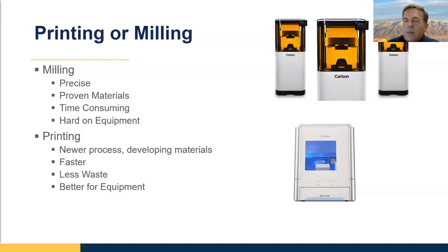And the wear and tear on the equipment is more predictable. Milling at the absolute point, like we talked about, at a micron level is slightly more accurate, but because of tissue deflection, it doesn't really matter. It doesn't create a perceptible difference for the patient. And one of the challenges with milling, especially in the maxilla, is that even with a 5-axis mill, you can get such a huge undercut that it's difficult to mill out accurately.